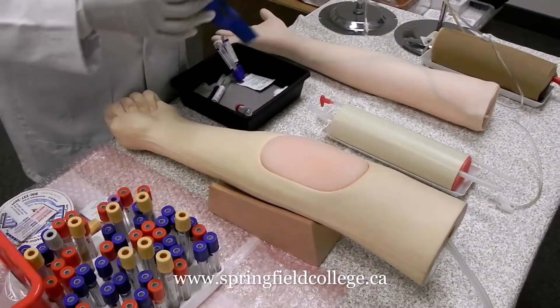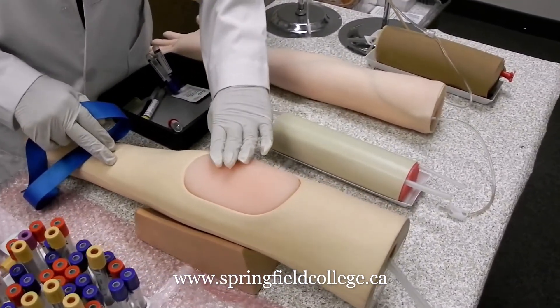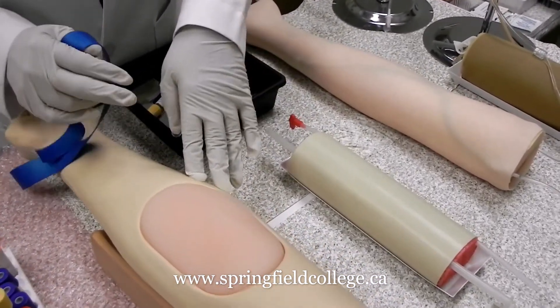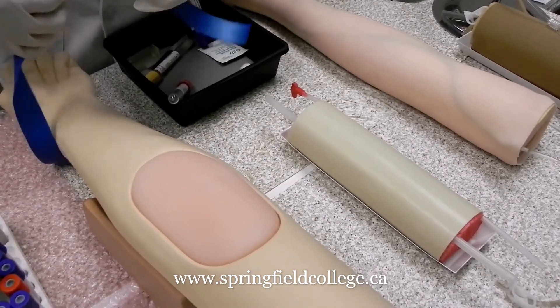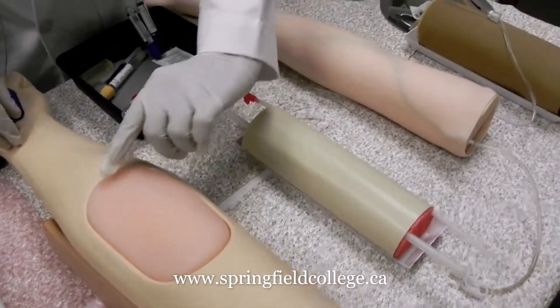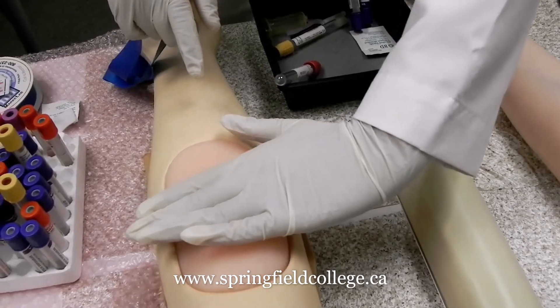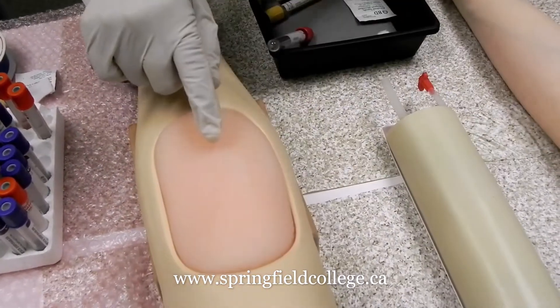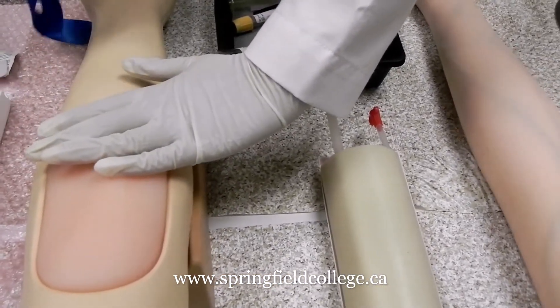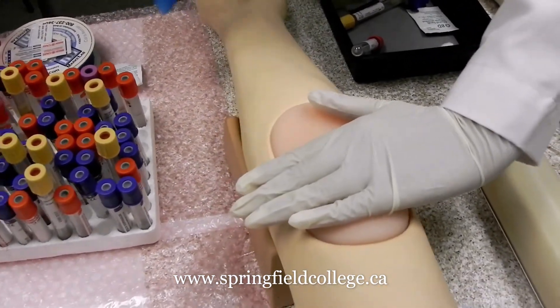Now first we look at the site selection. The antecubital area is the most preferential site for us, as we discussed previously. This is the antecubital area — considering this is the cubital fossa, just below this level we are going to collect the blood. Before that, we are going to select the area where we are going to apply our tourniquet.